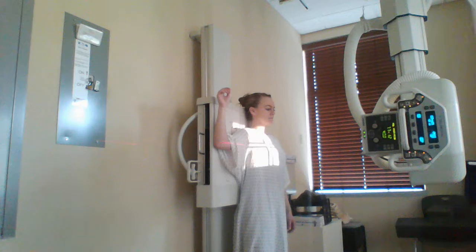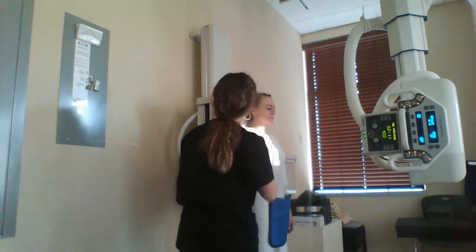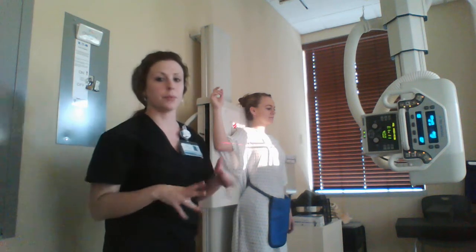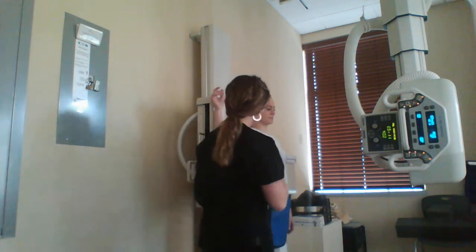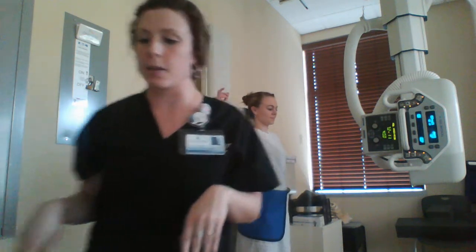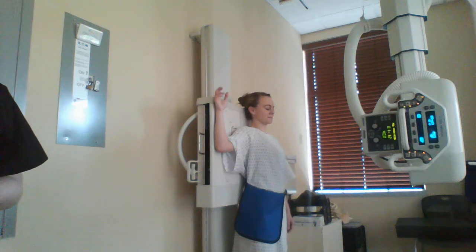Before I take the exposure, I'm going to shield the patient. And don't forget to mark it — put our right marker there. For this exposure, I'm going to have her breathe slowly. So just breathe real slow for me. Take the exposure. You can breathe normal. For the AP scapula, what you're going to see is the lateral portion of the scapula free of superimposition from the ribs, the scapula horizontal and not slanted, scapular detail through the superimposed lung and ribs, the acromion and inferior angle, and soft tissue and bony trabecular detail.